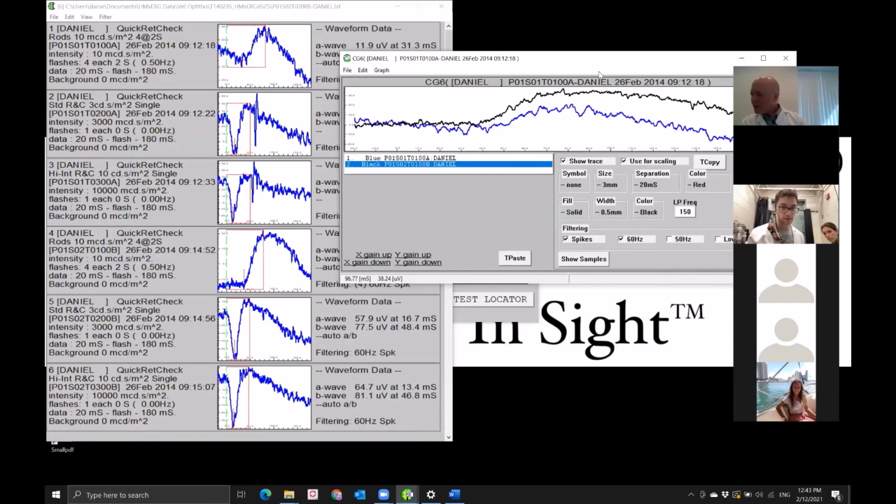Okay, what protocol settings do you suggest for assessing RPE functionality? So RPE, that's getting a signal construct for the RPE functionality. It's again a good question to be asked with Ron in the room, covering some of those aspects of what you can get on looking at functionality in RPE. Keep in mind that full field flash is a summary of photoreceptor response, and that's basically the summation.